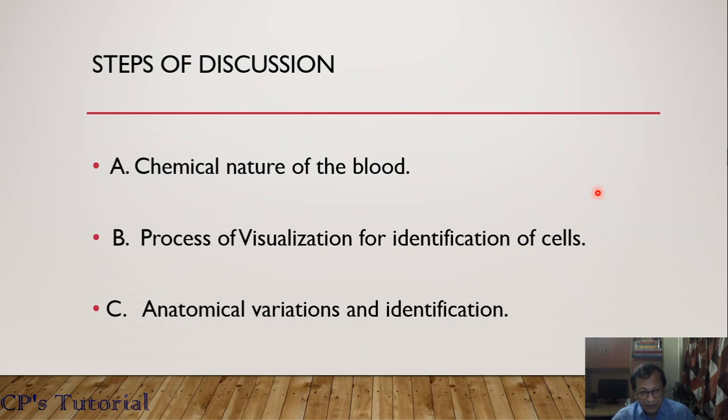Number two, I want to visualize all the cells for identification. Thirdly, the anatomical variations will be determined and observed for proper identification of those cells.